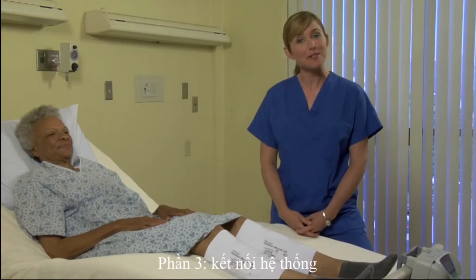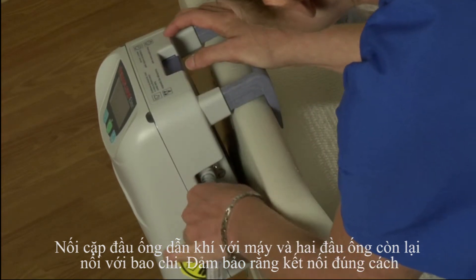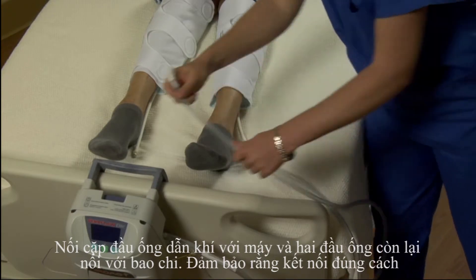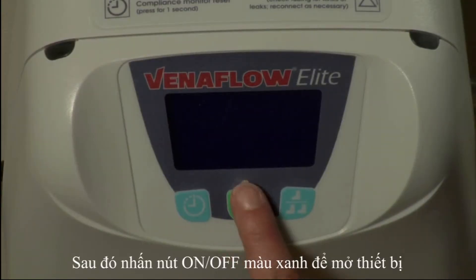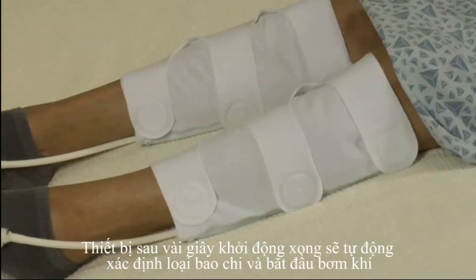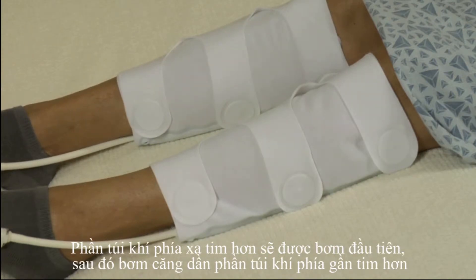The third step is to connect the system. Attach the tube assembly to the pump on one end and to the cuffs on the other. Make sure the connectors click securely together. Then press the green on-off button to power on the device. The cuffs will fill instantly, inflating the distal air cell first, then the proximal air cell a fraction of a second later.